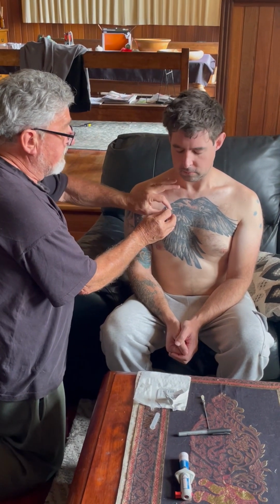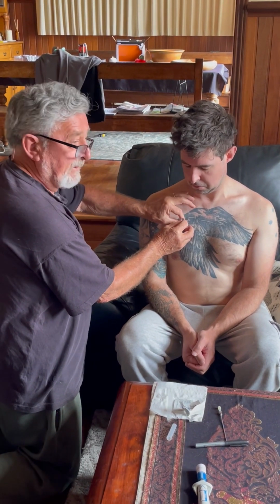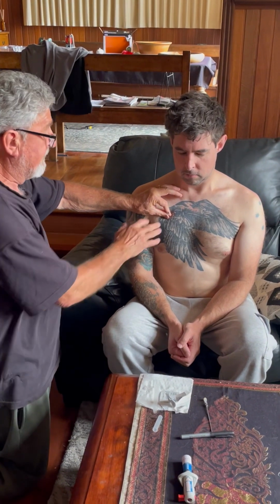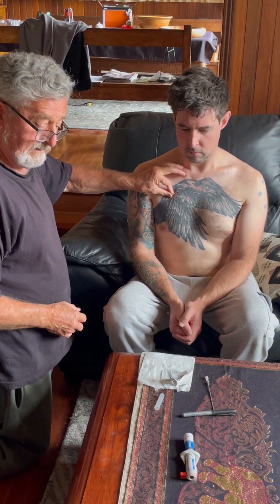And the next thing we've got to do is secure this catheter. The way we do that is we can put an Opsite around there, run some tape around there and tape that in. We just generally leave that in there until the tension is completely relieved. Okay, thank you.